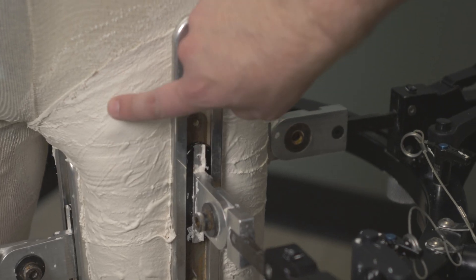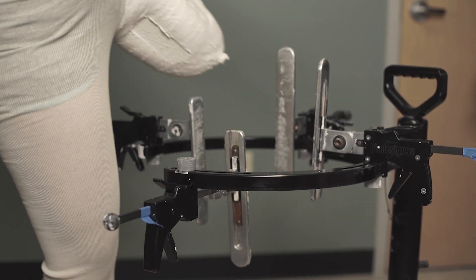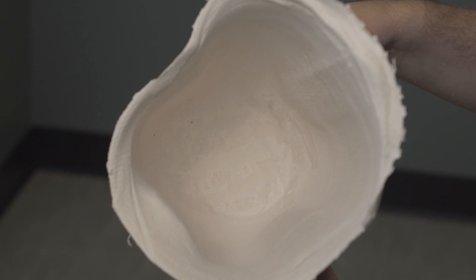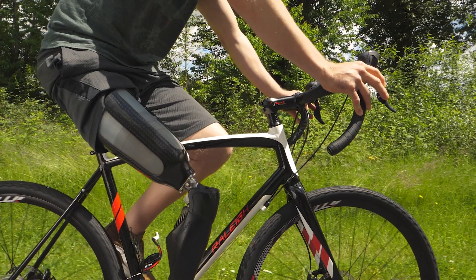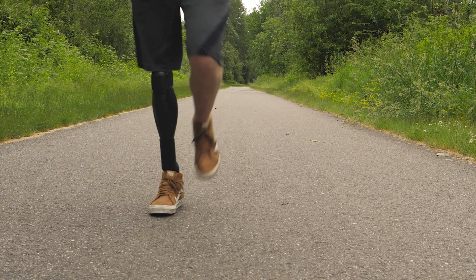The Hi-Fi Socket design can be incorporated with any suspension mechanism — there are no limitations. It can also be used on a variety of patients of different functional mobility levels. Whether you're someone who walks in the home, walks in the community, or even runs on their prosthesis, you can benefit from this design.